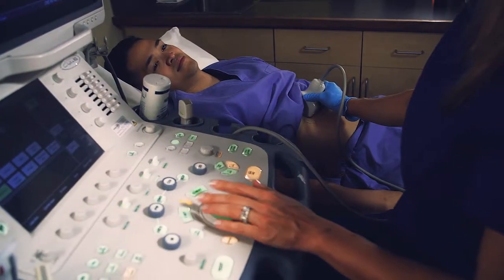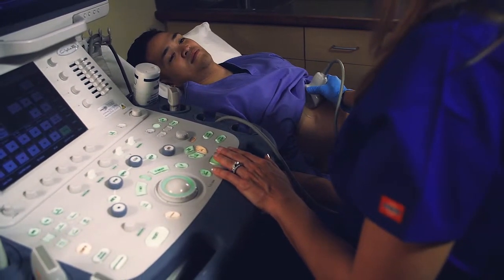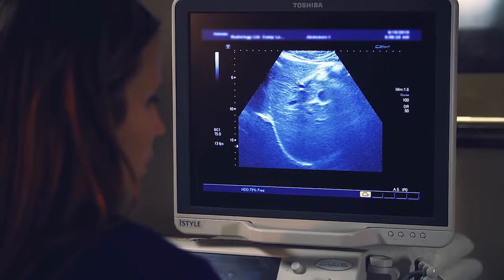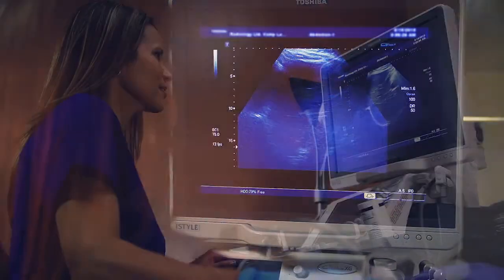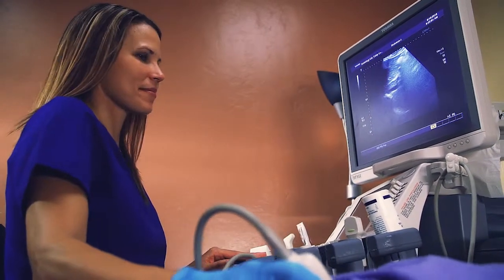The transducer generates and receives high frequency sound waves. The computer in the ultrasound unit processes and converts the resulting patterns into detailed images. This exam produces images of soft tissue and organs in the body through the use of sound waves that reflect back and are displayed as real-time images.